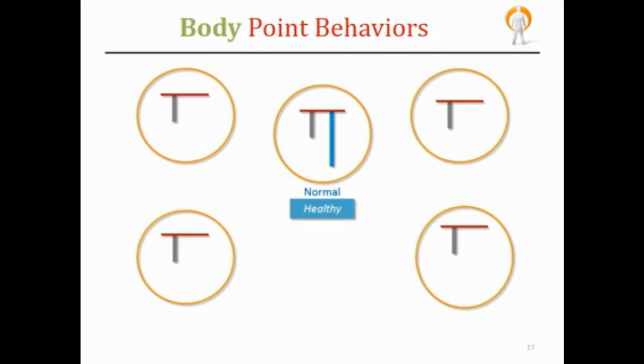The first one is when the second reading is the same temperature as the first. This is called blocked or rigid regulation and means that the underlying organ wasn't able to respond at all, or there was an overriding interference. So blocked regulation is most often seen when there's a lack of regulation capability due to organ dysfunction, a focal infection, heavy metals, or even scar tissue interference.